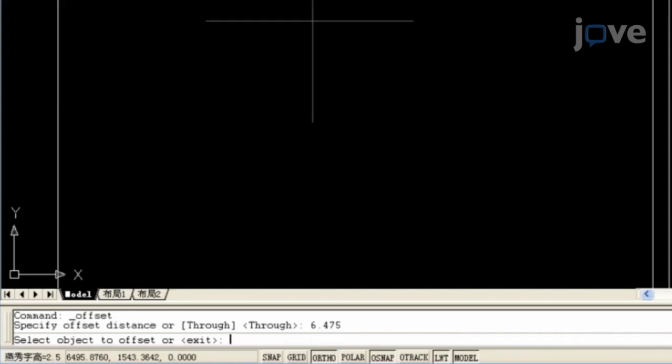To select the area to be trimmed, click Modify and Trim and click the extra line.